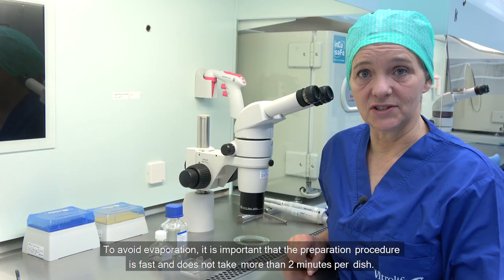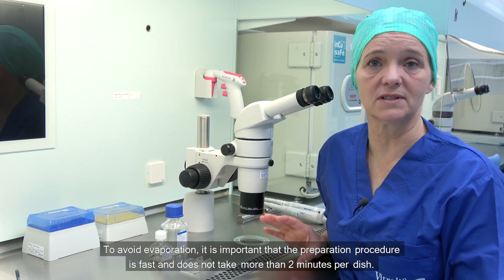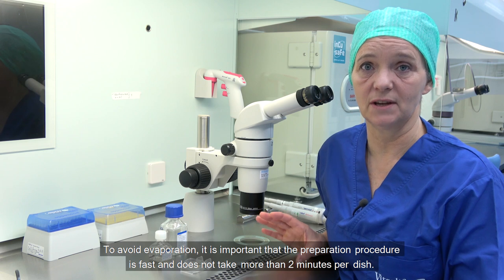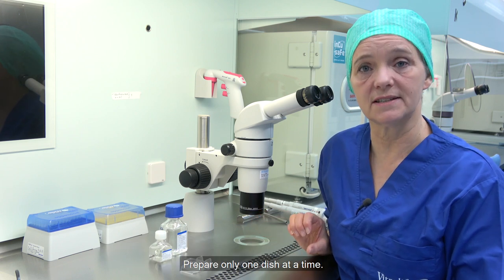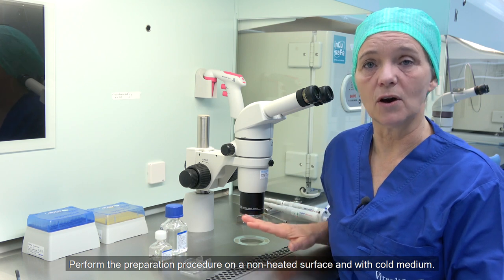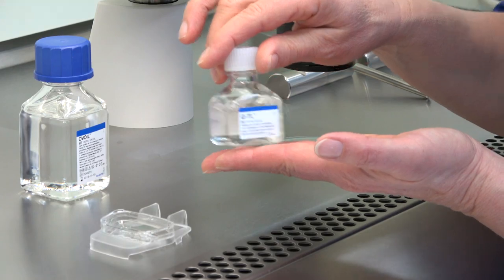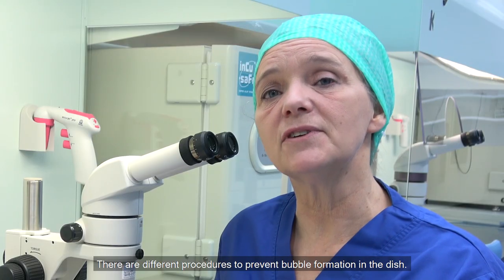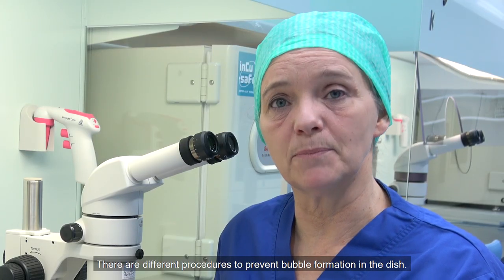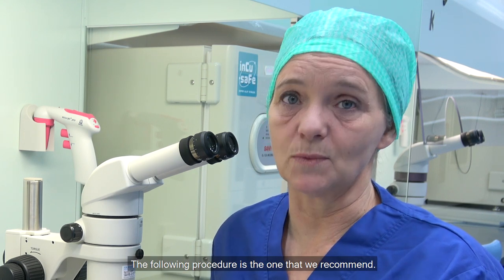To avoid evaporation, it is important that the preparation procedure is fast and does not take more than 2 minutes per dish. Prepare only one dish at a time. Perform the preparation procedure on a non-heated surface and with cold medium. There are different procedures to prevent bubble formation in the dish; the following procedure is the one that we recommend.